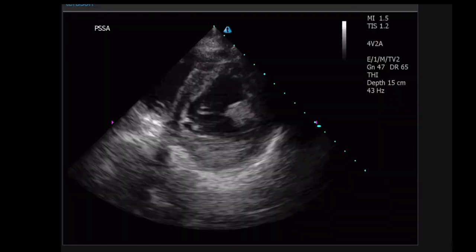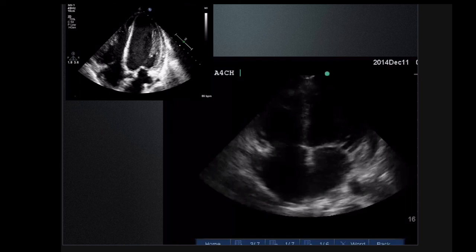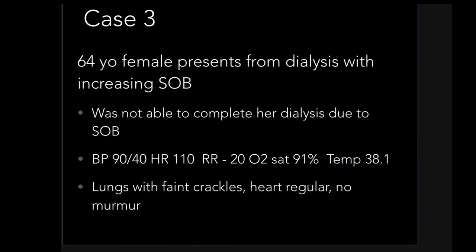Parasternal short is my double-check. When you give people comparisons, it's pretty straightforward that this patient's ejection fraction is good compared to that terrible ejection fraction. The apical four chamber is really just about relative chamber size — RV versus LV, and also the atria. A single dilated atrium is usually a sign of valvular pathology: massively dilated LA with fine rest usually means mitral valve problem; massively dilated RA usually means tricuspid valve problem.